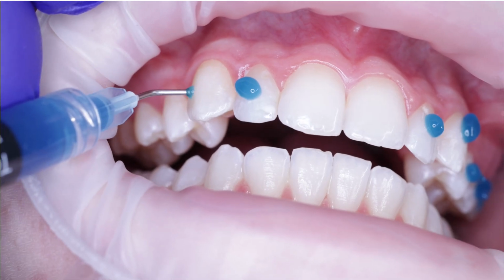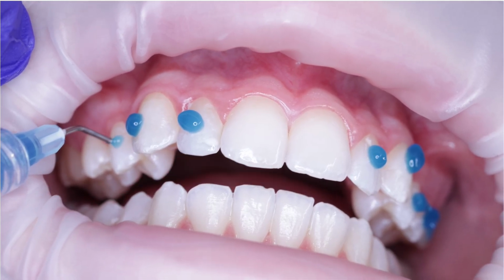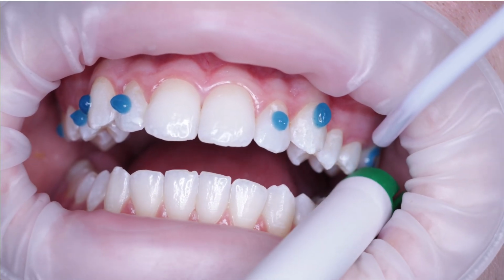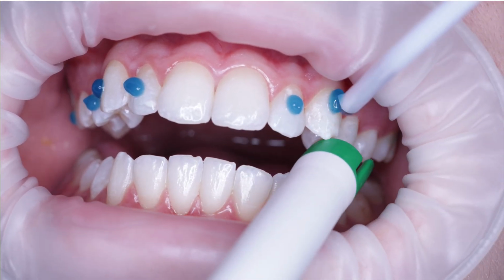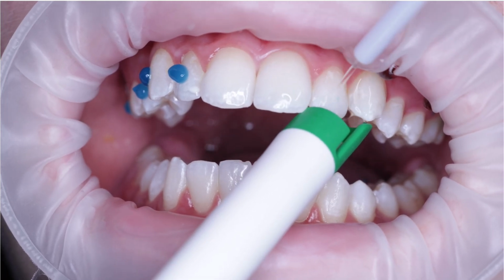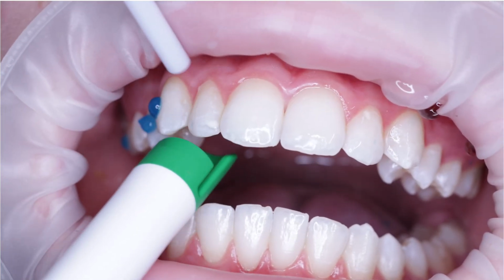Now, my doctor is very, very picky about utilizing a timer. And I can tell you that when you think about 20 seconds or 30 seconds, whatever the manufacturer tells you, that's when you want to set your timer. But if you start rinsing off when the timer goes off for those first two teeth, remember, we're going to under etch the rest. So for me, I set my timer when I've acid etched the last tooth. And I want to make sure that things are nice and frosty.